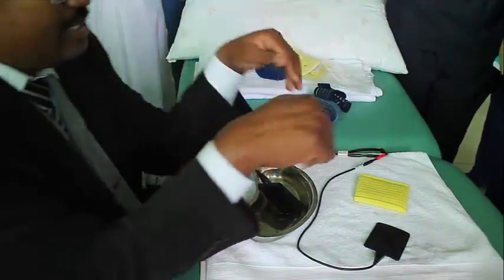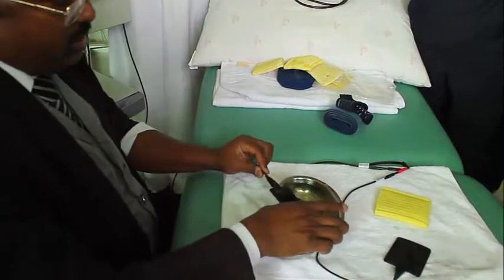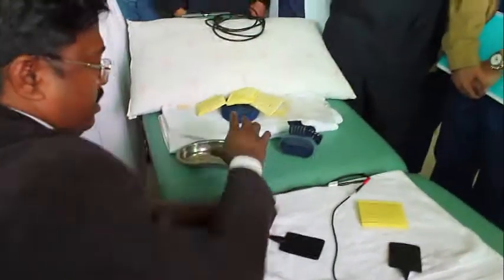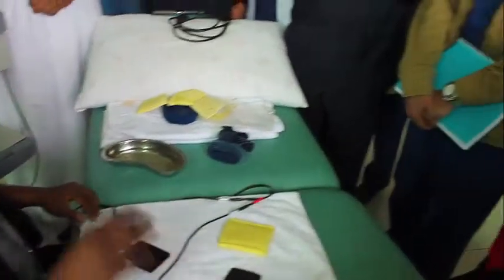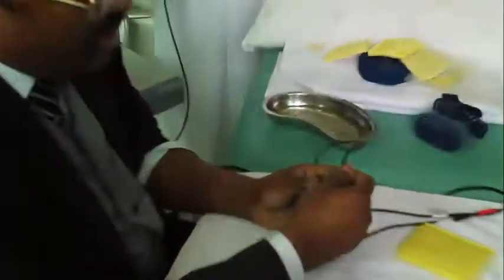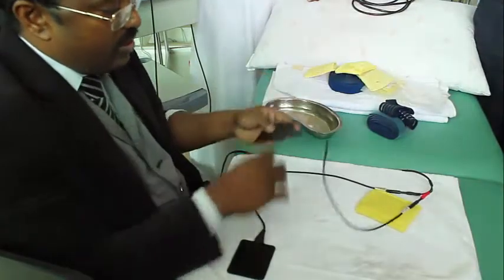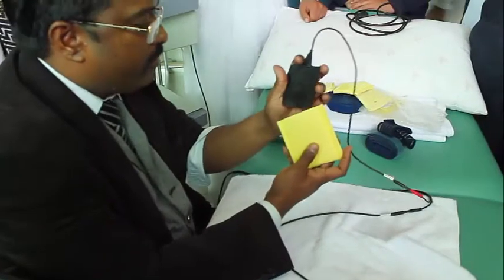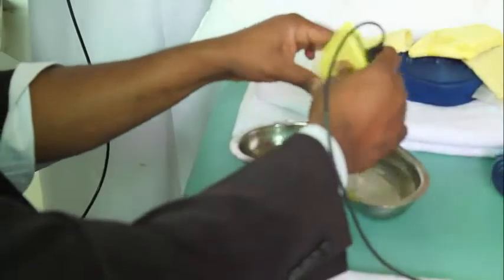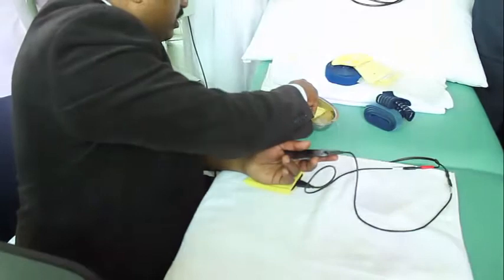So when you want to self-test, again, take a towel. Keep your hand onto the towel. You want to use cathode and anode, so 2 electrodes. This is cathode, this is anode. So I keep it inside, put a sufficient amount of water, then I keep my hand on that. The other one is, I take another electrode.